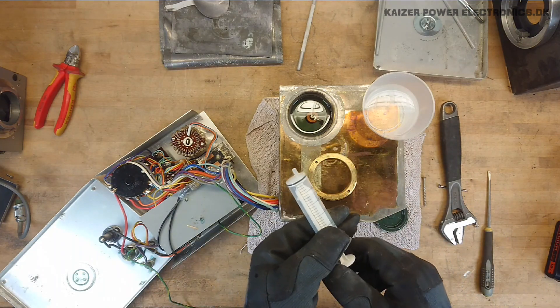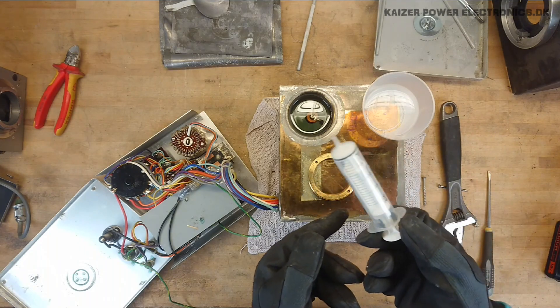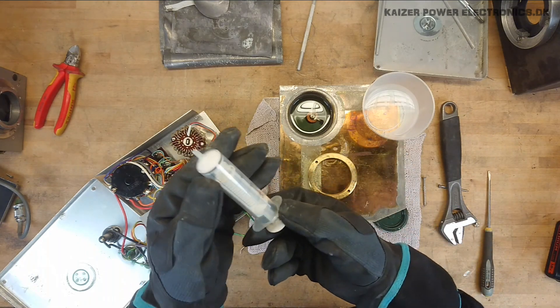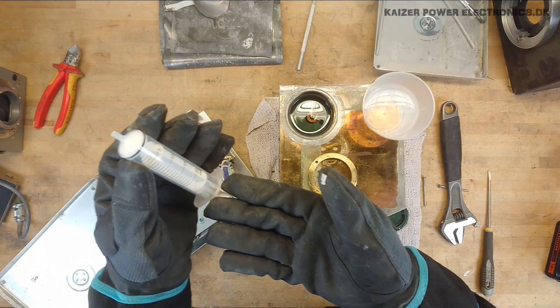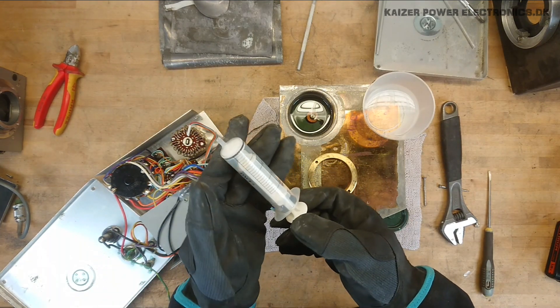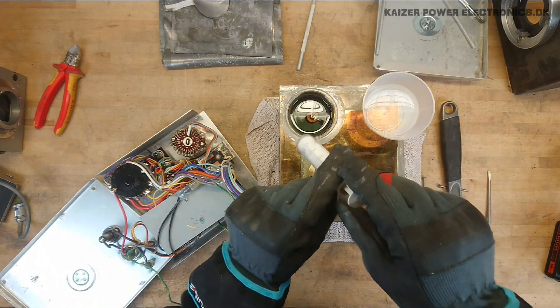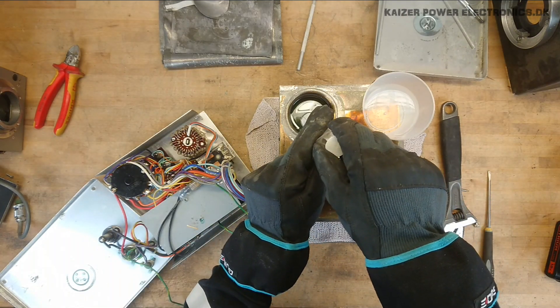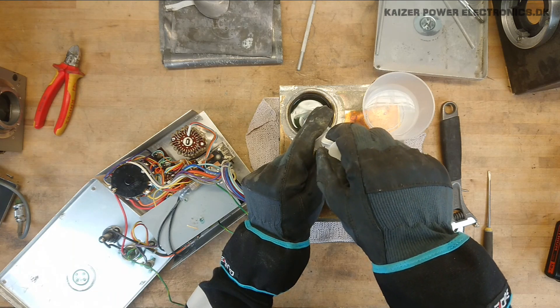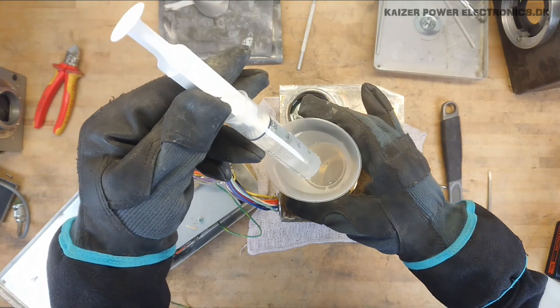I'm just going to use a syringe to suck up some oil, then add some water into it. Depending on how I turn it — if the oil goes to the bottom, so it's heavier than the water, then it is a PCB oil. And if it floats on the water, it's a mineral oil. That's a pretty easy and non-hazardous test to make. And as we can see, the oil actually floats on top of the water.